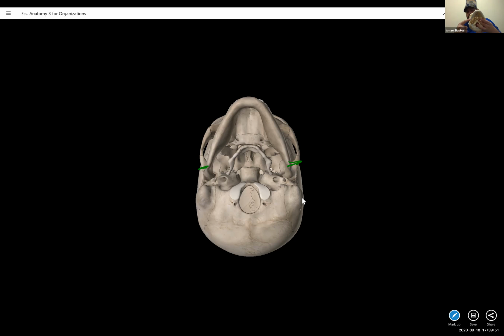So again, we're looking at the distance from the mandible to the lateral portion of the skull. So if this distance gets bigger, because here's the skull, here's the mandible, if that distance got bigger, then the vertex was tilted to the right side, because this is the right side of the patient. So again, if the distance on that one side gets bigger, then the vertex was tilted to that side.